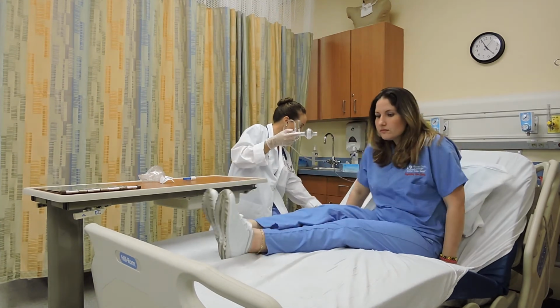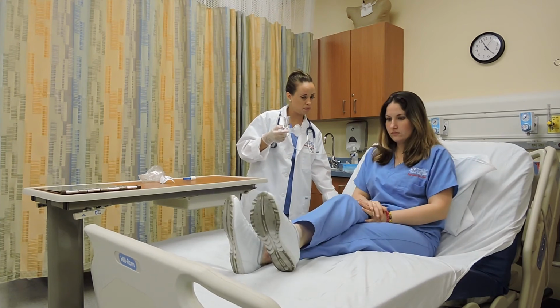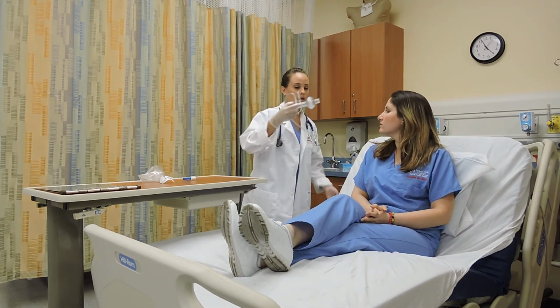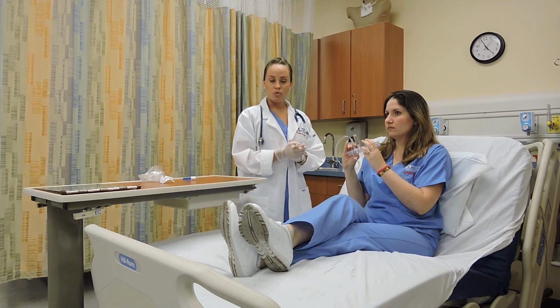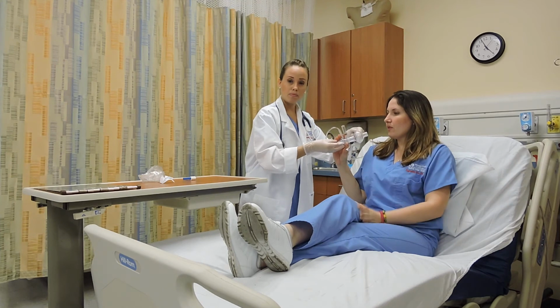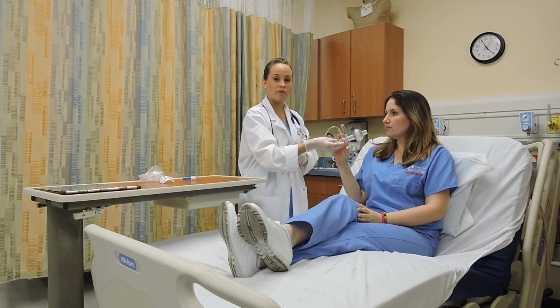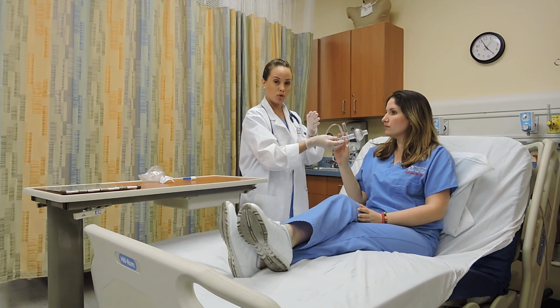Ms. Sanchez, I'm gonna need you to sit up straight and comfortably. Hold this for me, please. Then this is what we're gonna do. You're gonna form a tight seal around the mouthpiece. You're gonna inhale from your diaphragm to a volume greater than your tidal volume, but not to your total lung capacity.